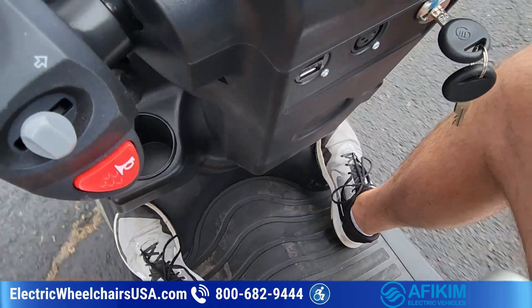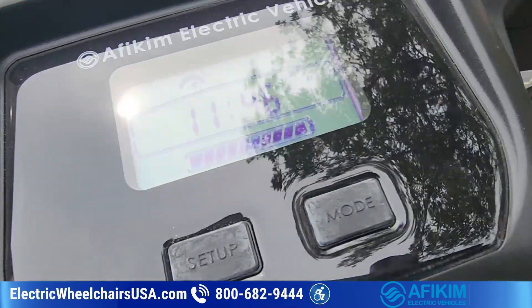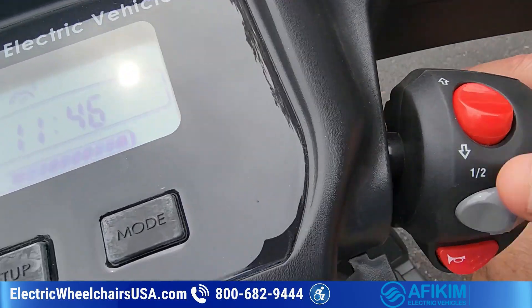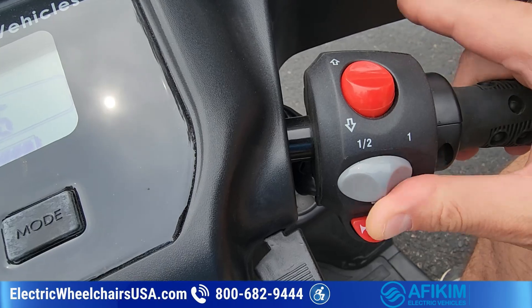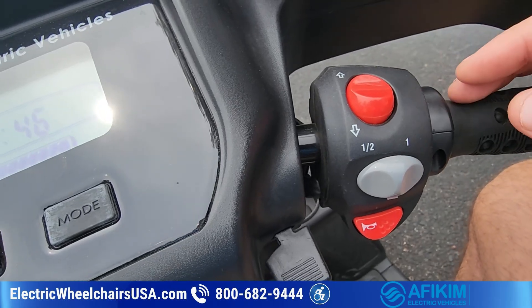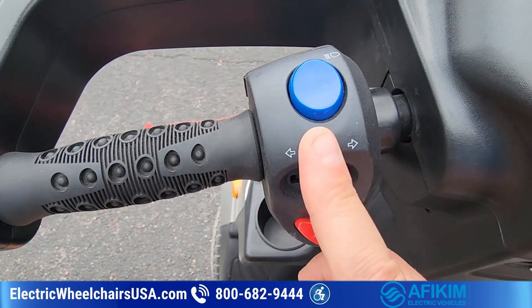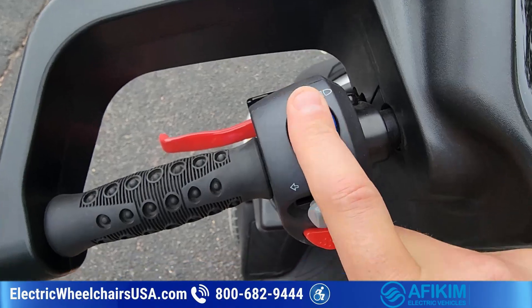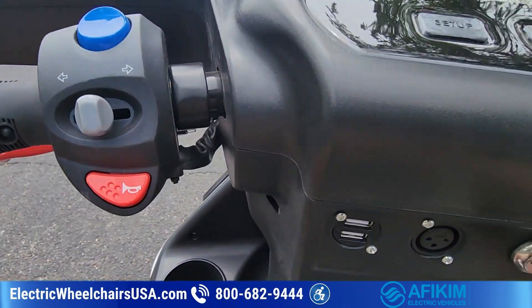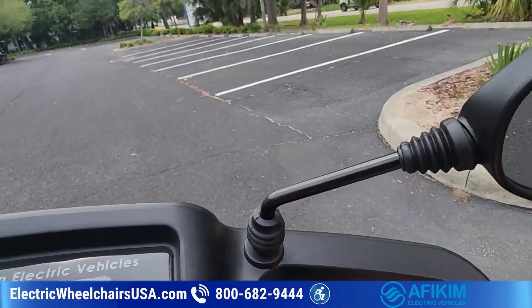There's plenty of leg room. Going over the controls: this is your forward and reverse switch, and this is your speed control. Half speed tops out at about five miles per hour; full speed is about ten miles per hour. You can upgrade to a high-torque motor to reach about 12–13 miles per hour. You've got a horn on both sides, left and right blinkers, a front headlight, a hazard light button, two cup holders, a charging port, and dual USB charging ports. The mirrors are also adjustable. This control setup is identical on both the S3 and S4.